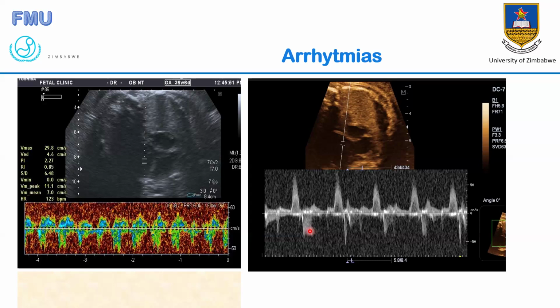So even if we do not have communication from the sinoatrial node, which is found in the right atrium, sorry, the AV node will be the origination of the contractions. The AV node beats at a very low pace of around 60 beats per minute, and it will beat in a regular way. This is what we see here.